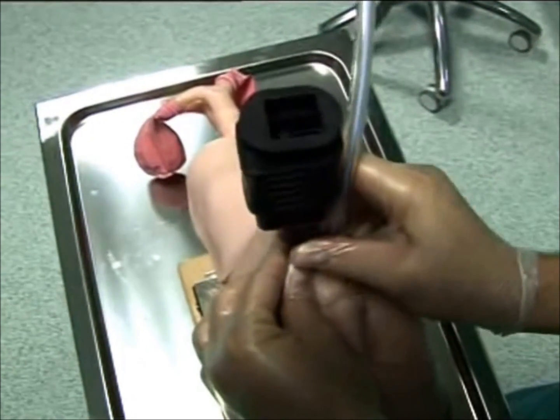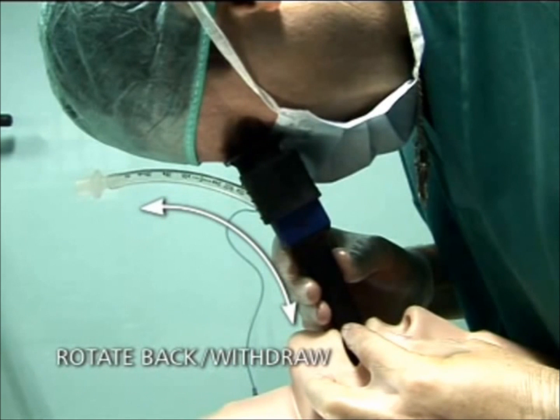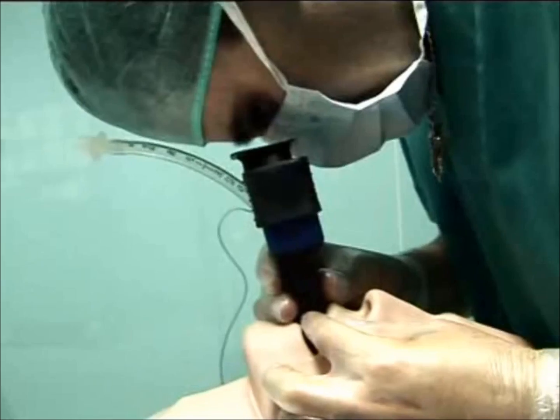To obtain full exposure of the glottis and to facilitate tube insertion, it may be necessary to withdraw the air-track slightly. In all cases, it must be lifted up.